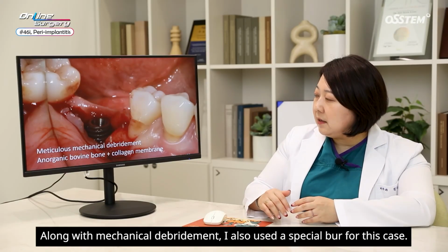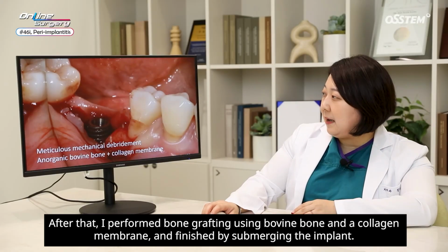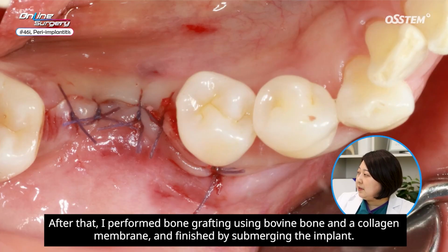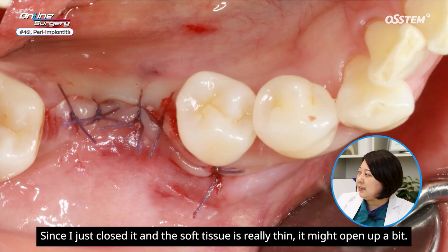Along with mechanical debridement, I also used a special burr for this case. After that, I performed bone grafting using bovine bone and a collagen membrane, and finished by submerging the implant. I didn't perform much of a vertical releasing incision for the flap. Since I just closed it and the soft tissue is really thin, it might open up a bit.